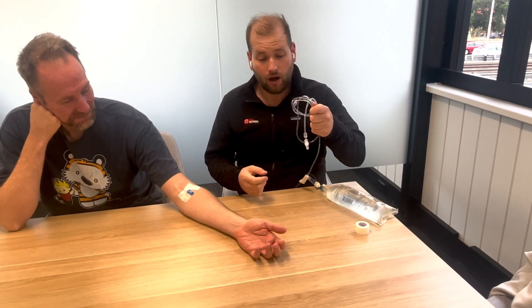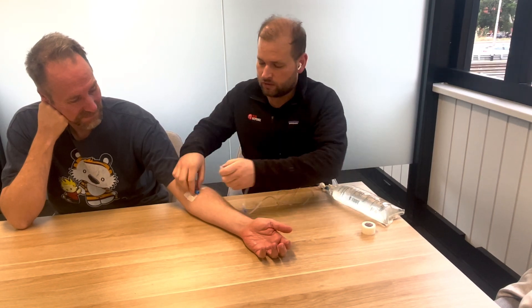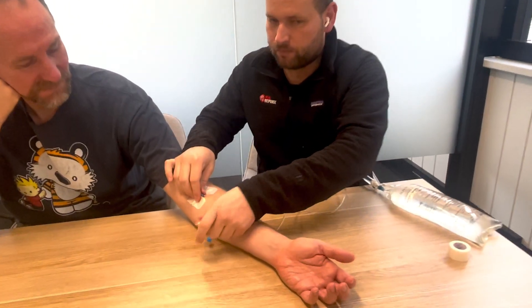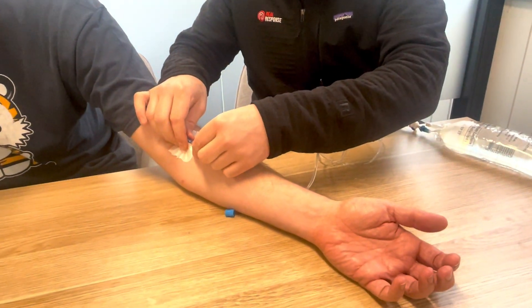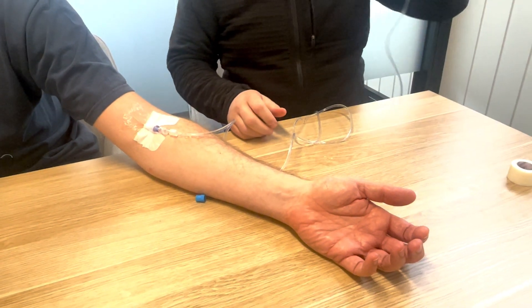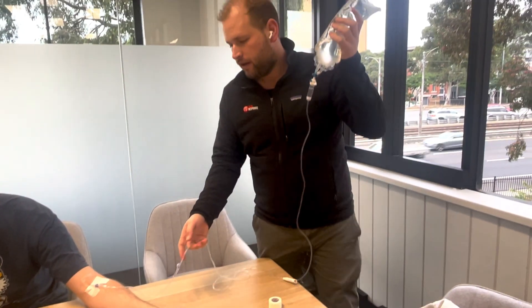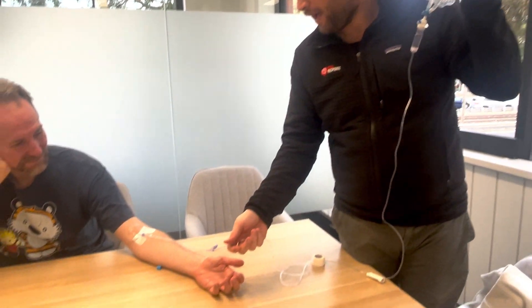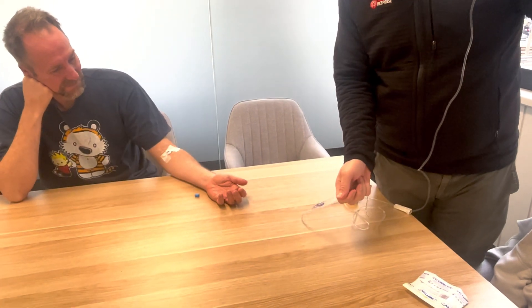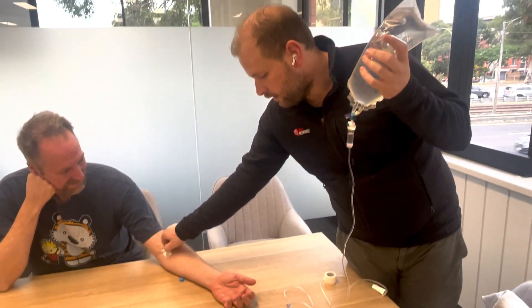What I'm going to show you now is how to tie a giving set in. The problem is, if I just take this and connect it up, tie that in, and then just let this strip through — what can happen if Jules pulls his arm backwards — I've now completely lost my cannula. This can easily pull out if it's not secured properly. So I don't want to do that.